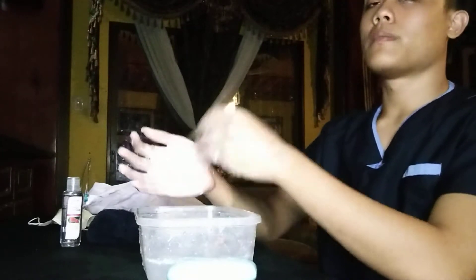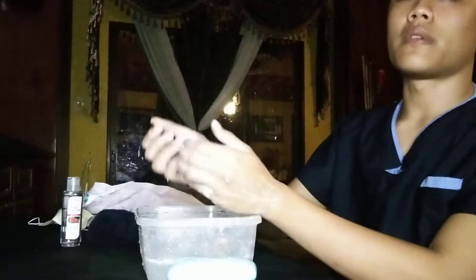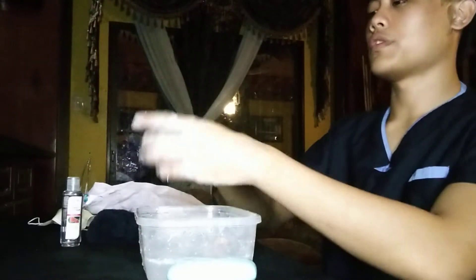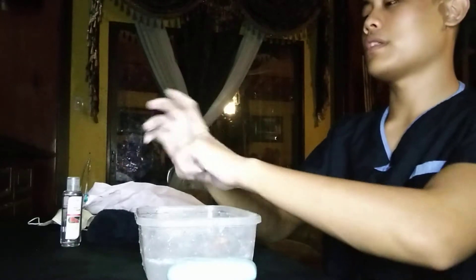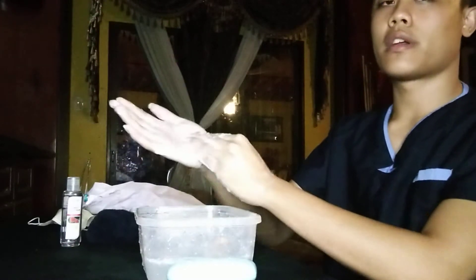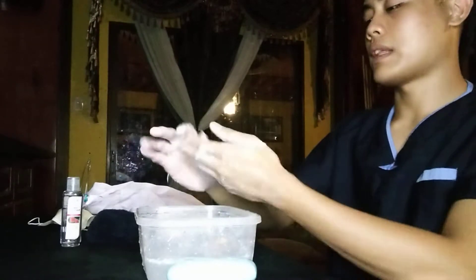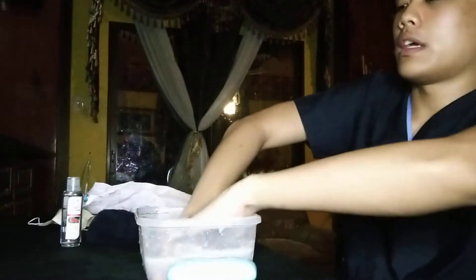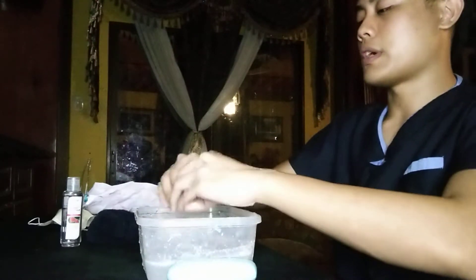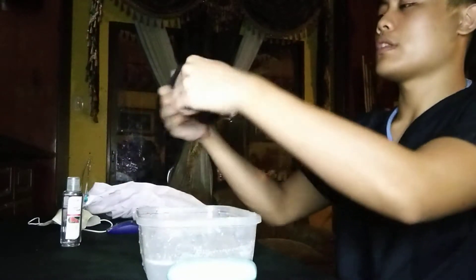Six, place the back of your fingers to the opposing palm with fingers interlocked. Seven, do rotational rubbing on your left and right thumb, and also rotational rubbing on your clasped fingers. After that, wash thoroughly again with running or warm water, and dry it thoroughly with a dry towel or dry tissue.